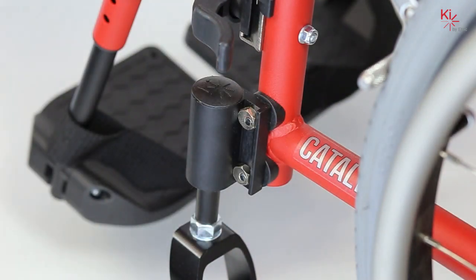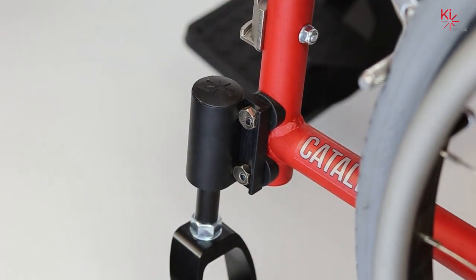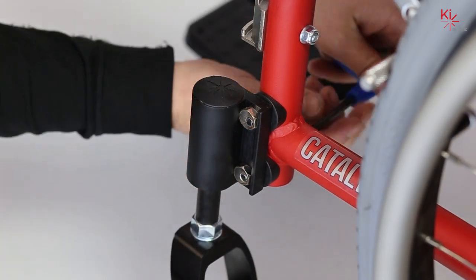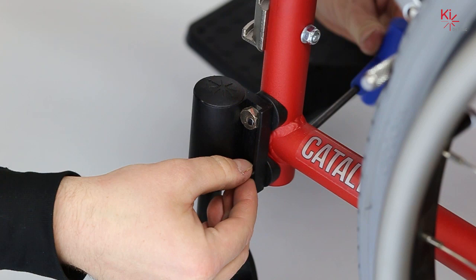The first step is, using your five millimeter Allen key, to loosen the screw on the interior of the front frame until you're able to pull your eccentric nut from the caster housing.